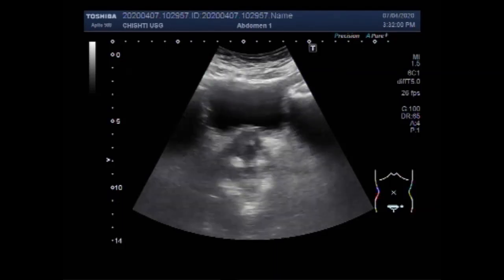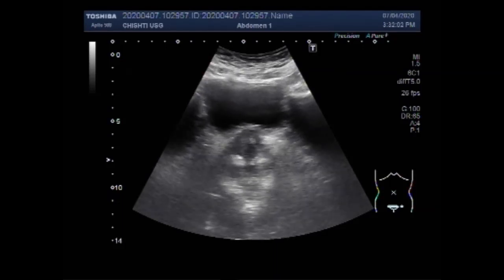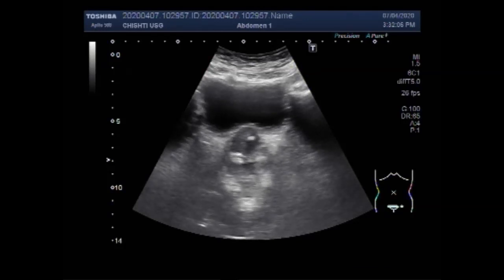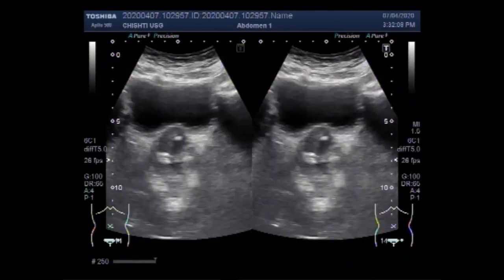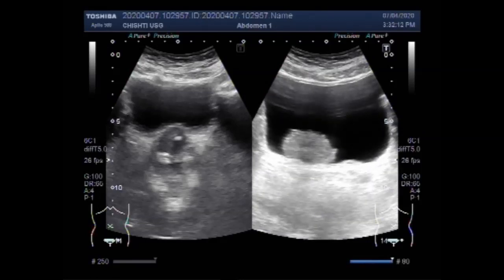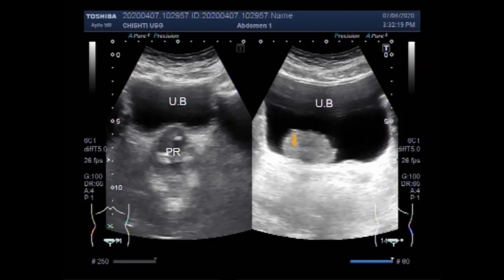Now you can see the enlarged prostate and the large growth in the urinary bladder. The urinary bladder is one of the basic abdominal organs assessed during transabdominal ultrasound examination for urological reasons.